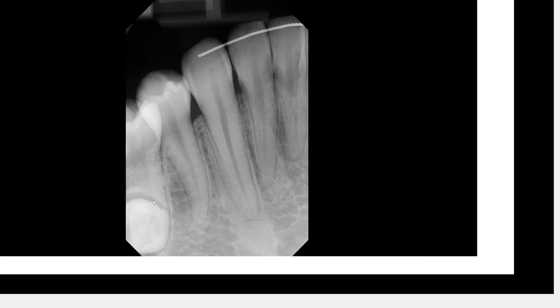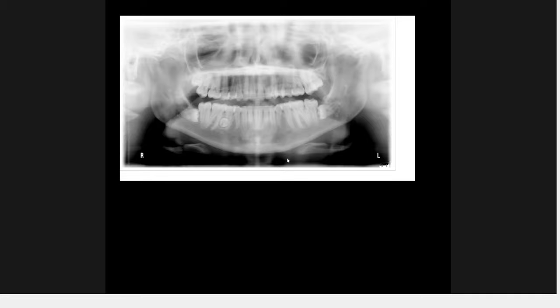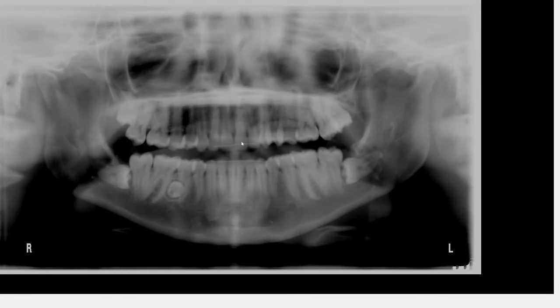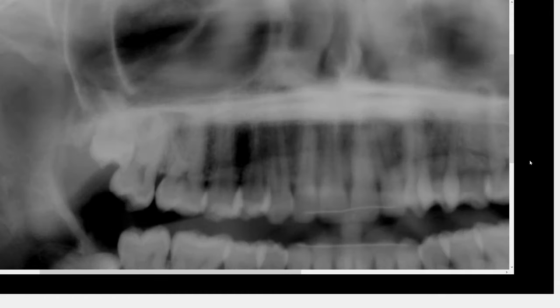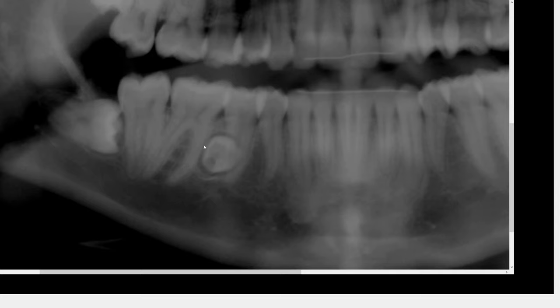Before moving to the panoramic, I want to show that entity one more time from the canine periapical projection. Now on the pantomograph, zooming into the area of interest — supernumerary or odontoma remain the best differential diagnoses. We see radiodensity very similar to enamel, and certain areas appear similar to dentin density, with some pulp tissue density visible as well.